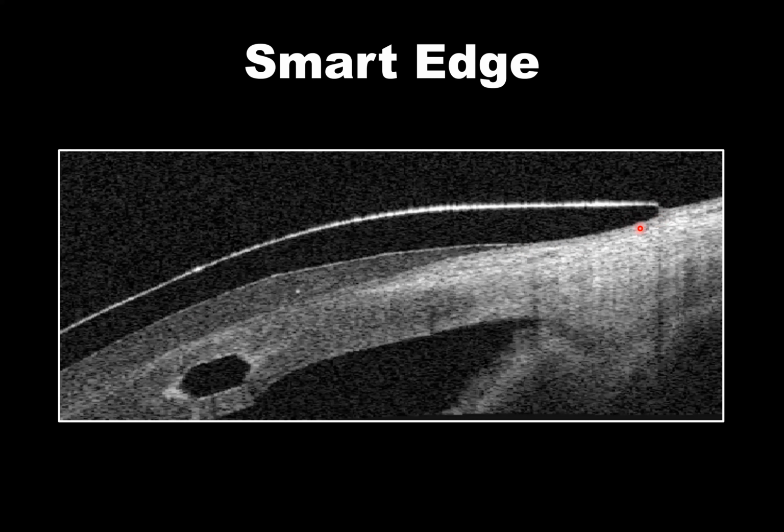And this is the ideal lens to conjunctival relationship that reduces the blanching, that reduces the red eye, that creates a comfortable fit with the eye, that creates a good physiologic response.